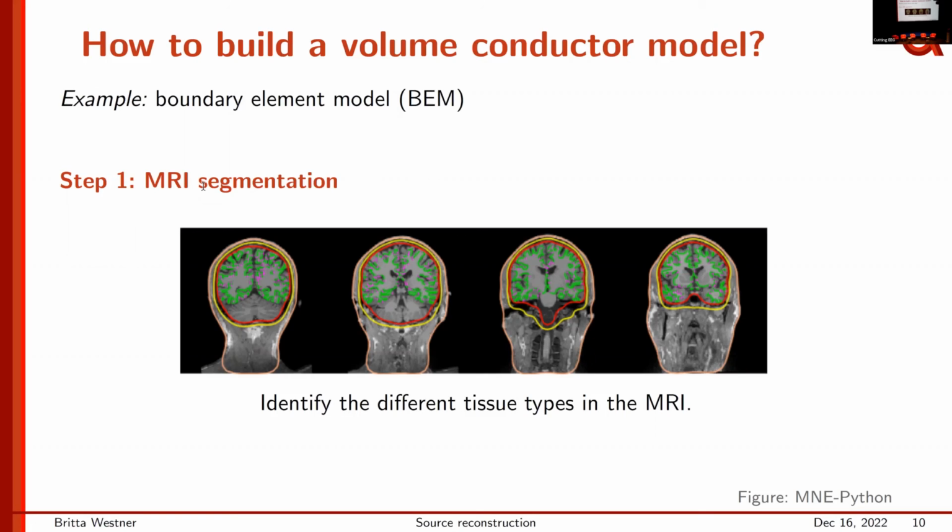But if it's a channel that looks a bit more noisy than the others, beamforming might not be very impressed by that and just work fine. So also there, I think you have this continuum of how bad it is, where on one hand you don't gain anything by keeping this channel in, and on the other hand, it might look weird on your sensor data, but might not result in trouble in beamforming.